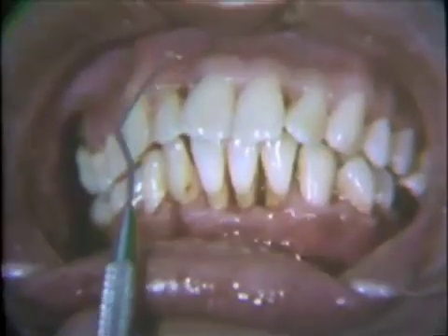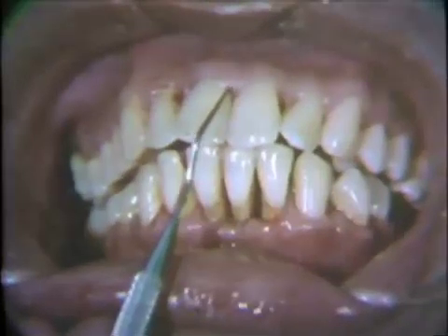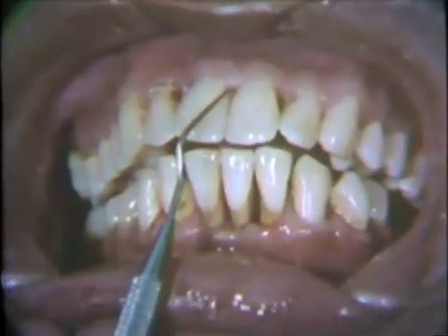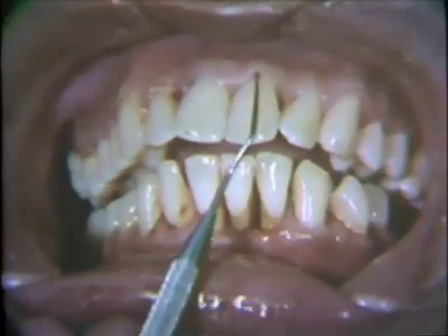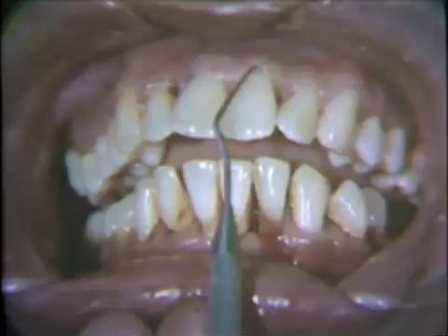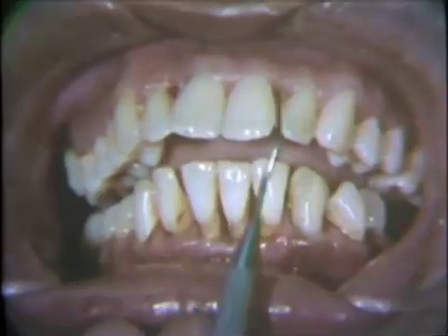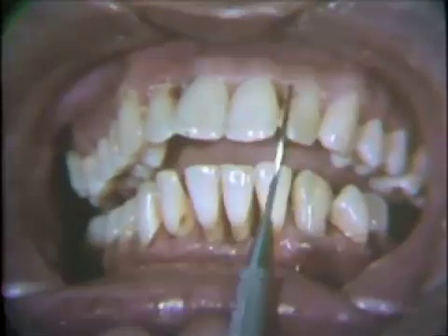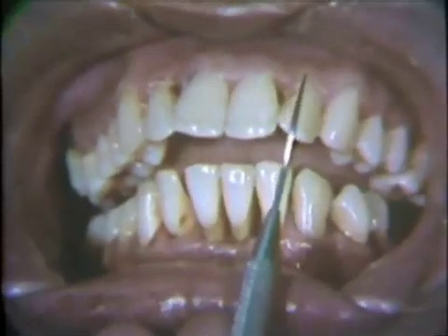After scaling and root planing, the tooth surfaces are checked with a number 17 explorer to assure that all calculus has been removed and the tooth surfaces are smooth. The instrument should be placed into the gingival crevice with its tip flat on the tooth. Then the tip of the instrument is turned toward the tooth to feel for irregularities.